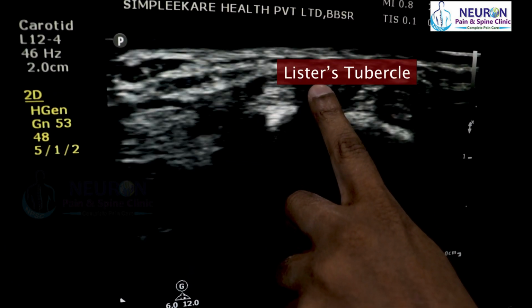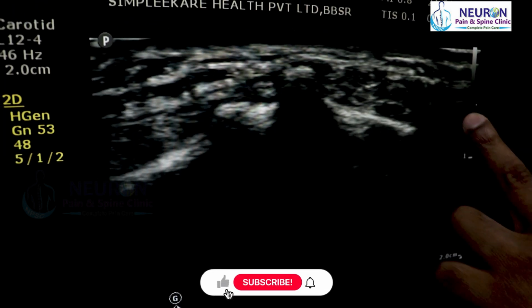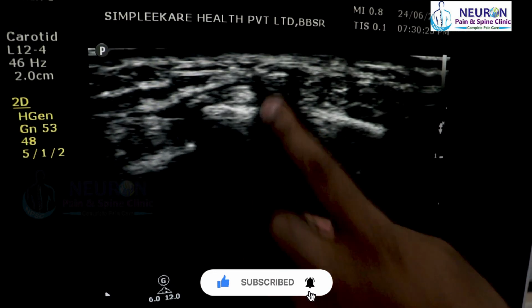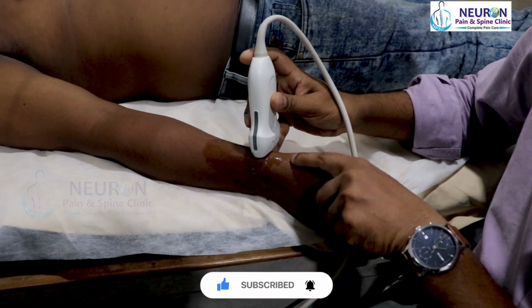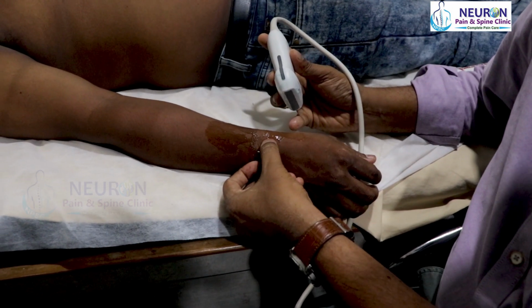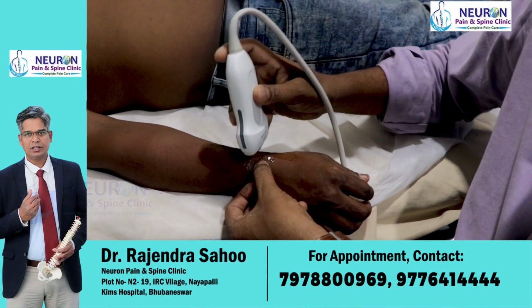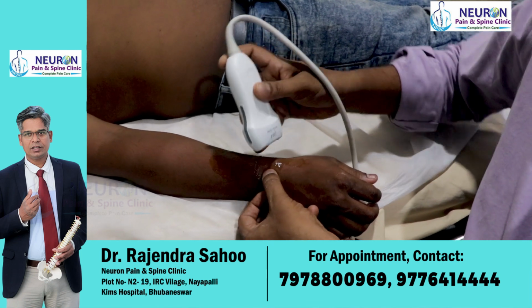Some people find it very difficult to identify the radial styloid, which is the first and second compartment. You can start from here instead of the first compartment: move here and feel for that prominent mark, called Lister's tubercle. That separates the second and the third compartment.